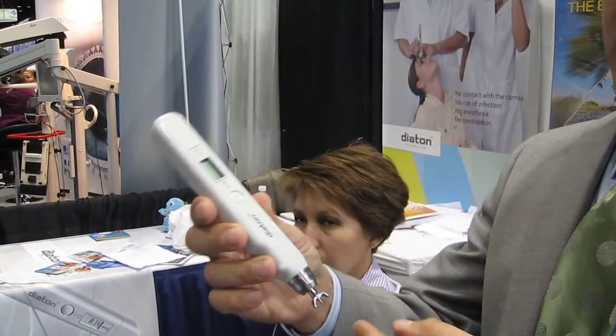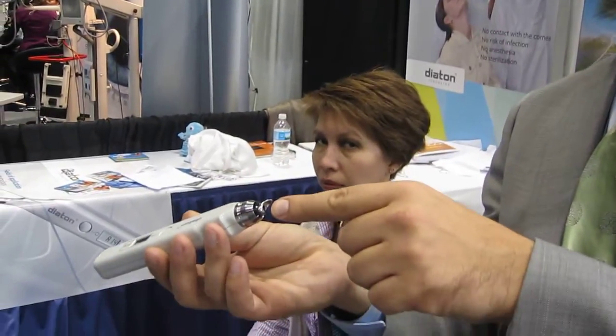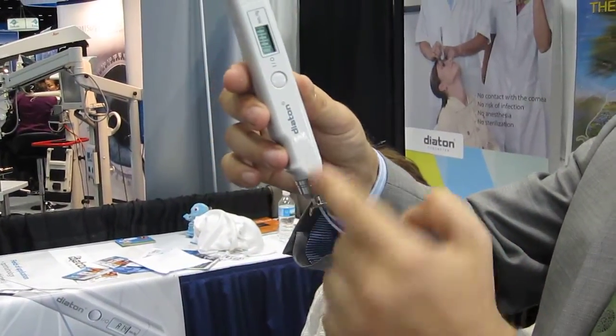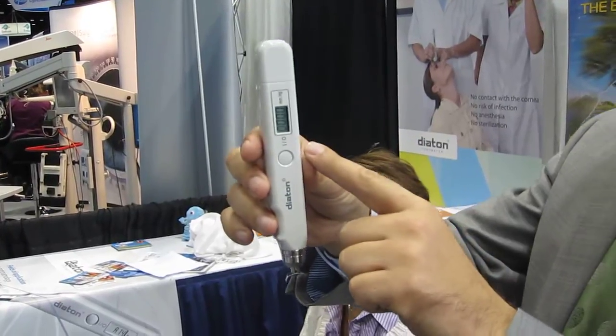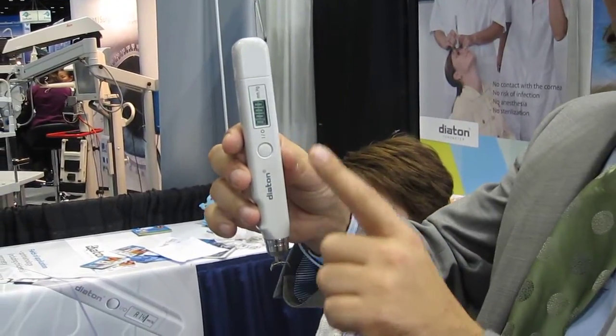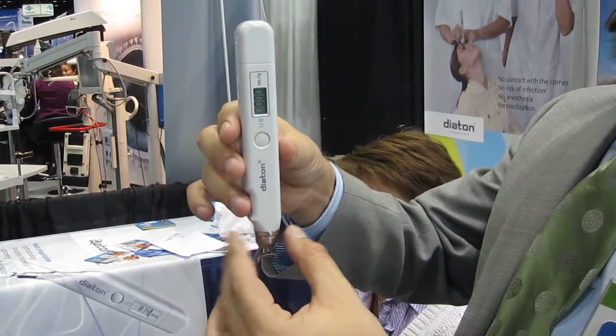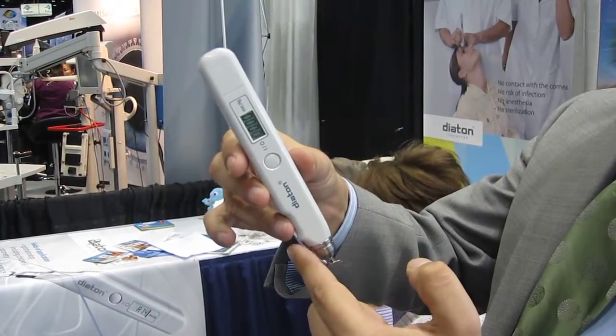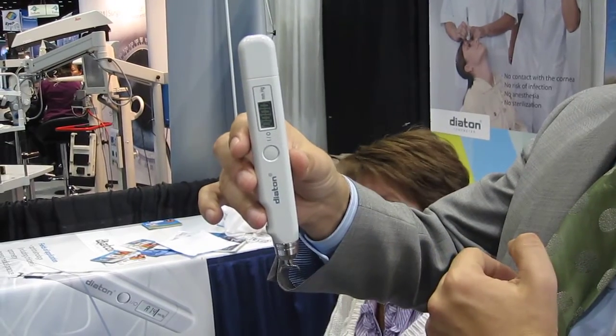To operate it, simply tilt back so the middle floater falls inside the body of the tonometer, then come back to the initial position. There is a beeping sound which is an indicator for the user to find the vertical position. When you're vertical, the beeping stops. When you deviate from the vertical position, the beeping sound returns.